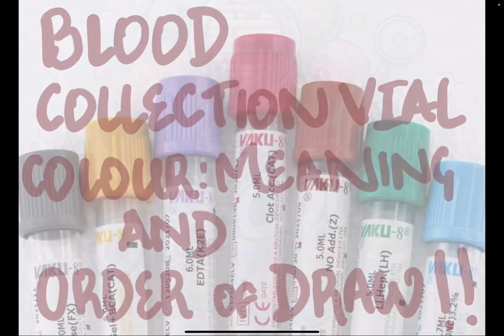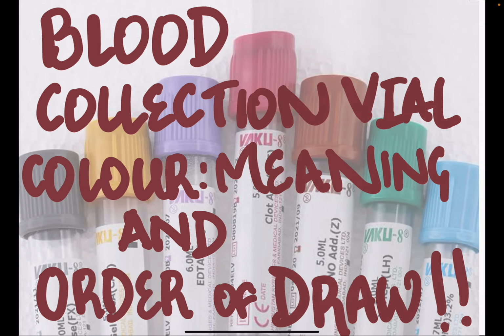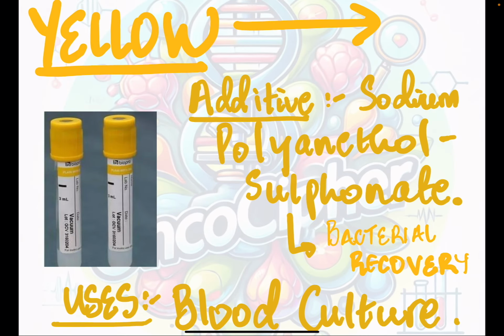In today's yet another very important topic, we'll be discussing blood collection: the colors, the meaning of these colors, and the order of the blood drawn into them. Now, each of these vials has a specific colored bulb which is coated from within with an additive which has its purpose. So, the first one is a yellow colored bulb which has no gel in it.